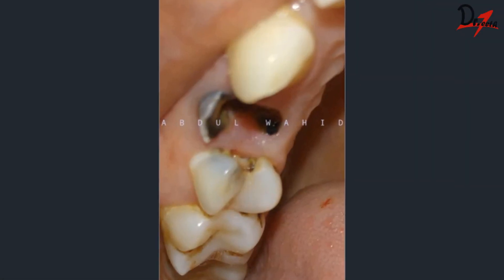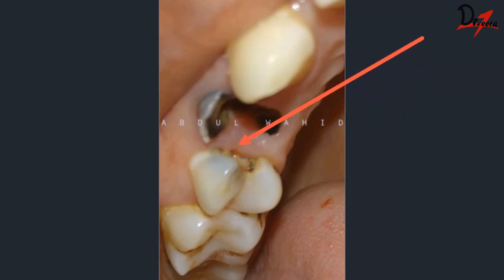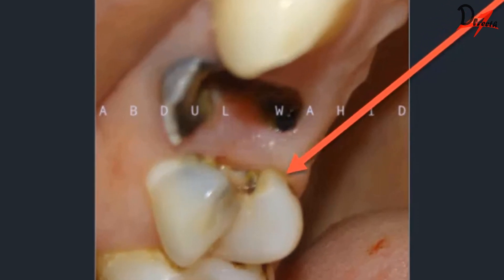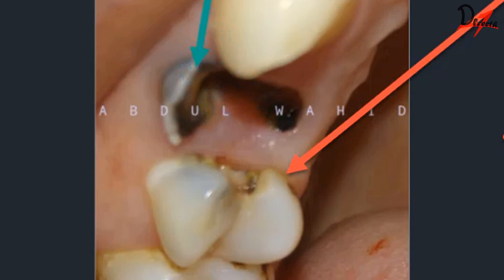Today we will be discussing a case of root canal treatment on a premolar. As you can see, this premolar presented with proximal decay. We will first discuss the challenges we are going to face. The proximal decay looks below the level of the gingiva. Also noteworthy is the adjacent premolar, which is grossly decayed and has ragged and sharp edges.